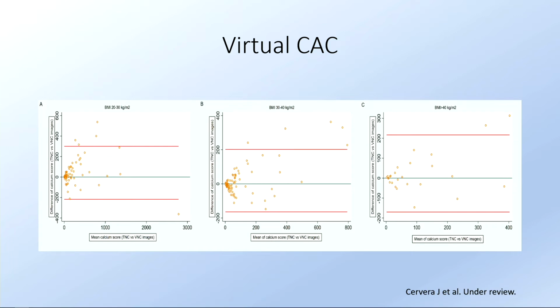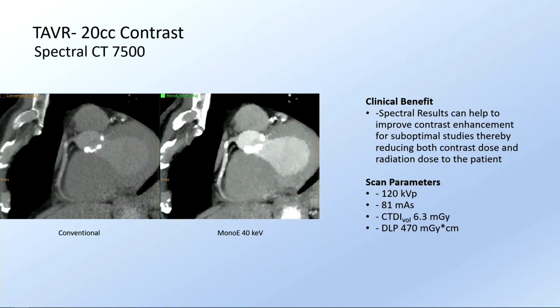We excluded patients here with a calcium score of 0, because if you image 0, that will lead to 0, and this was a problem with some publications, and it will inflate your correlations. So these were all patients that had calcium in the coronary arteries. And I think the value is more when it's higher. If you have lower values of calcium, that may be a little bit more tricky.